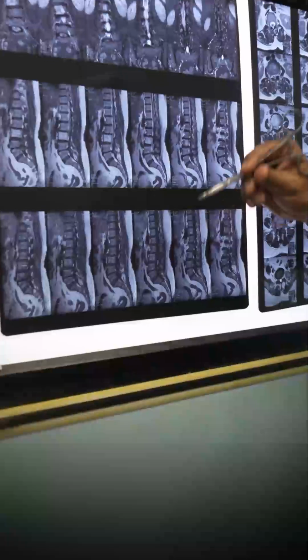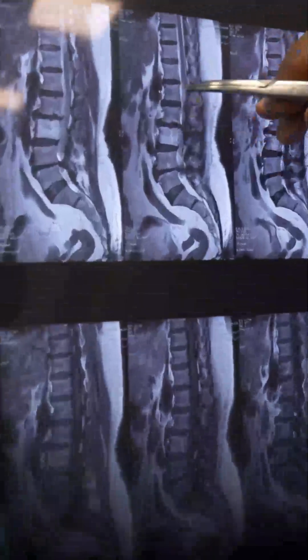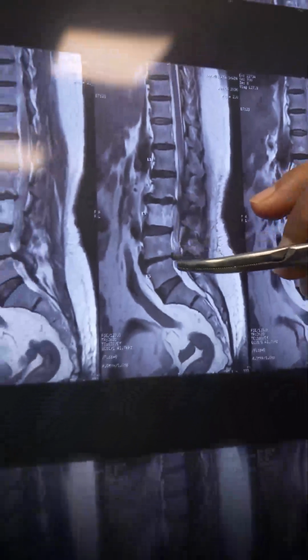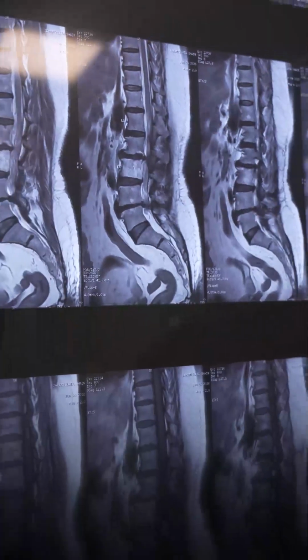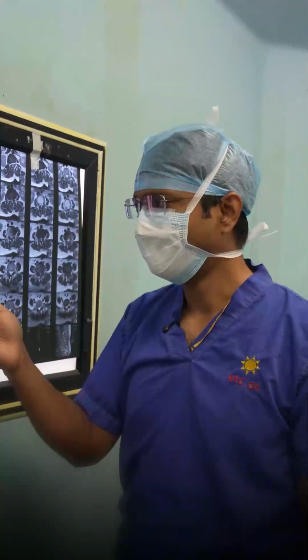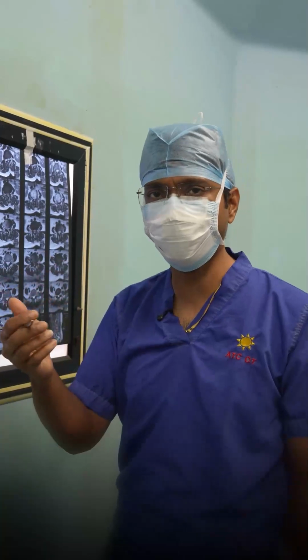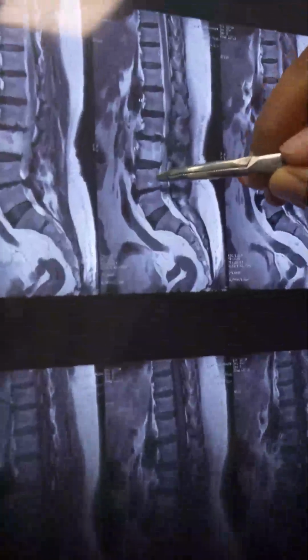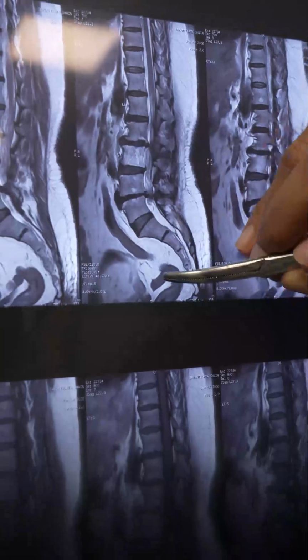So in the MRI you can identify all the bones. You can see this is L1 or lumbar number 1, number 2, number 3, number 4, number 5. So these are different numbers. This nomenclature is for identifying different vertebrae. So you can see this is L4 or 4th lumbar vertebra, this is L5 or 5th lumbar vertebra.